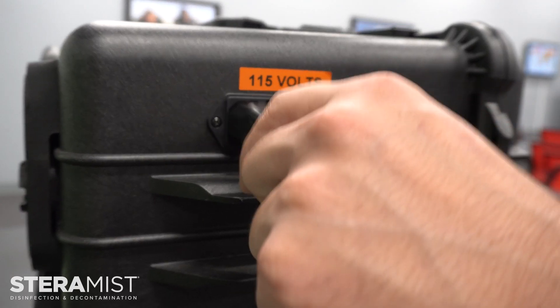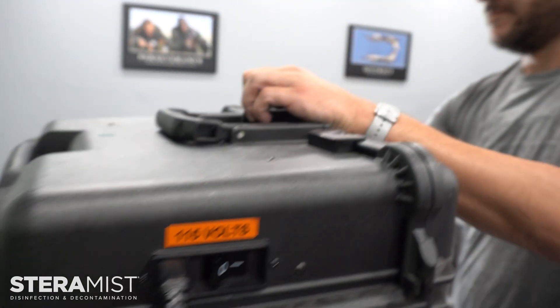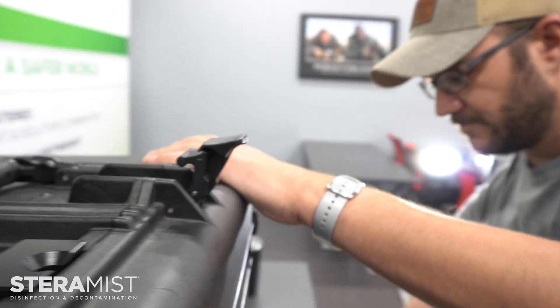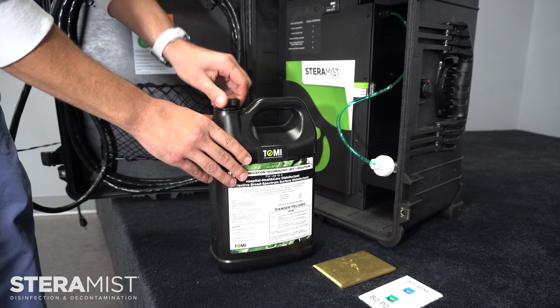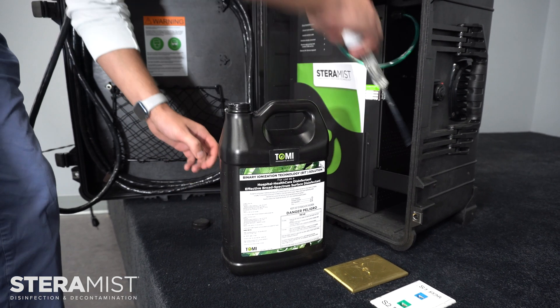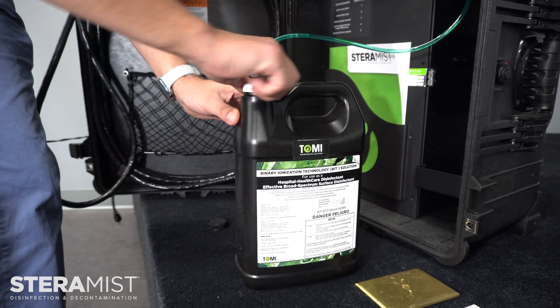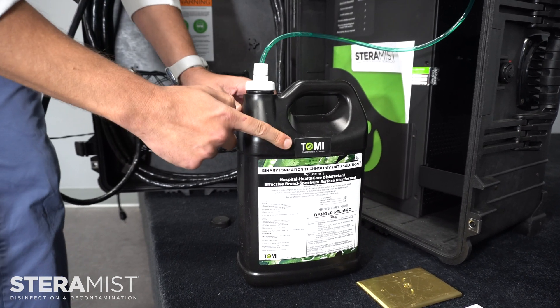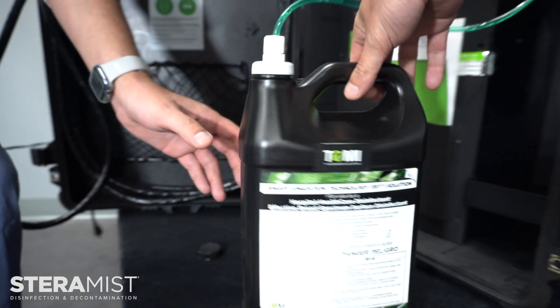Using the surface unit is extremely easy. Start by plugging the unit in, then open the case. Place the dip tube into the bit solution bottle and secure the bottle inside the unit. Make sure the cap is secure and the RFID reader is facing the correct direction before placing the bit bottle in the unit.